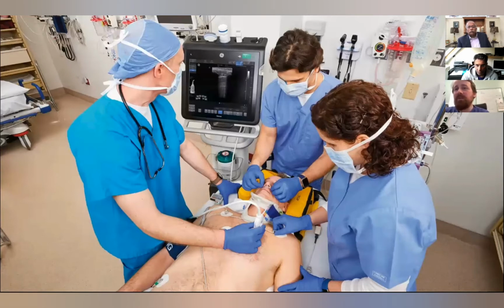So what does it look like? Point of care ultrasound looks like this. This is an image of a post-trauma patient being assessed for a pneumothorax. There's an ED physician on the left-hand side doing a lung ultrasound, having a look to see if this patient needs intervention before they're stabilized and moved to another department. It is real time. It's a physician who's doing the images, and this is just so you have an impression in case you've never come across point of care ultrasound being used before.